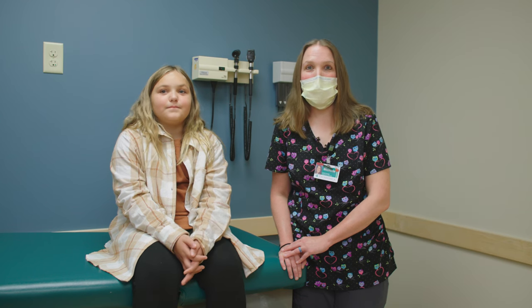Hi, my name is Michelle. I'm a registered respiratory therapist here at Eby Children's Hospital. Today I'm going to show our patient how to properly use a spacer with her inhaler, otherwise known as a puffer.